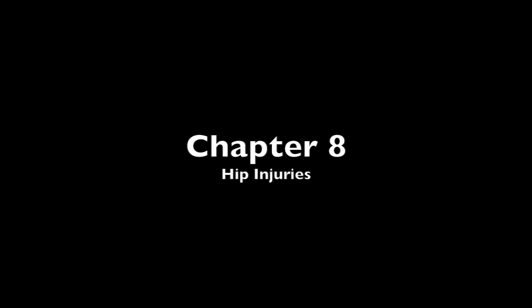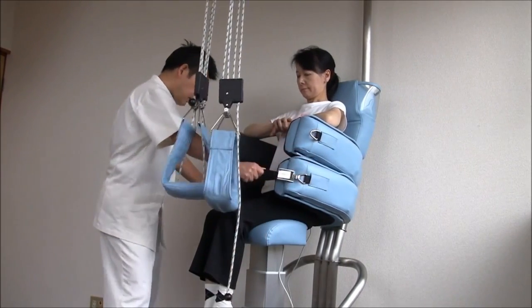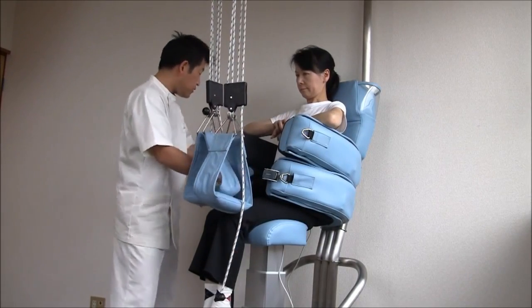Chapter 8: Hip Injuries. If the patient is having hip or pelvic issues, make sure the lower cushion is firmly tightened. This will help reduce some of the pain in that area.